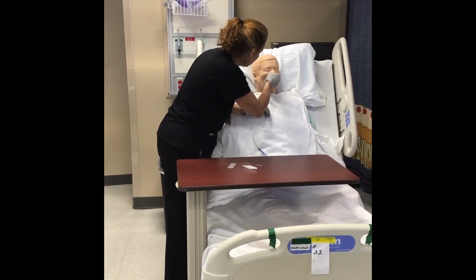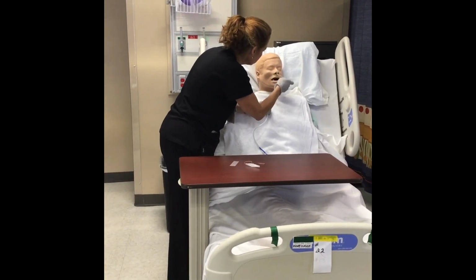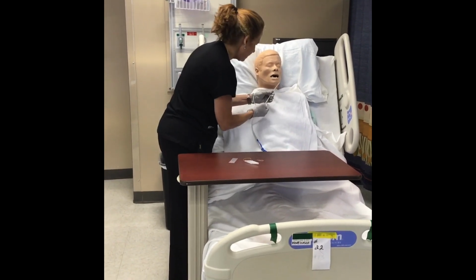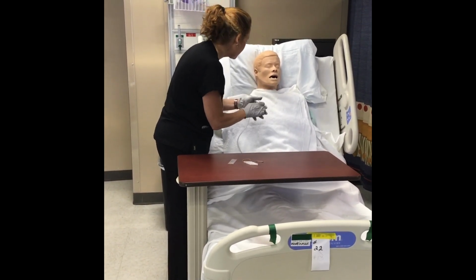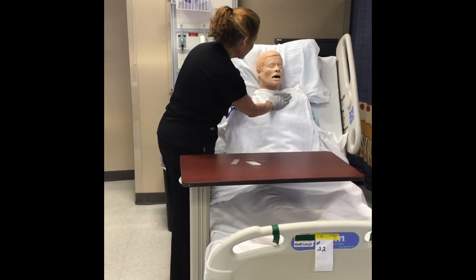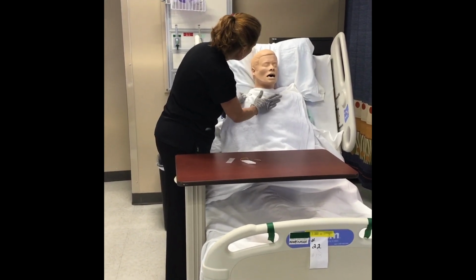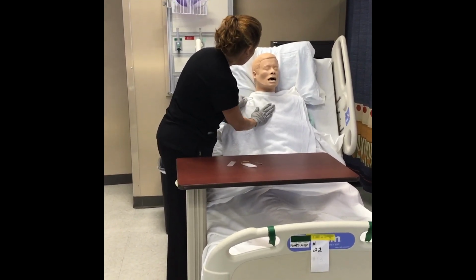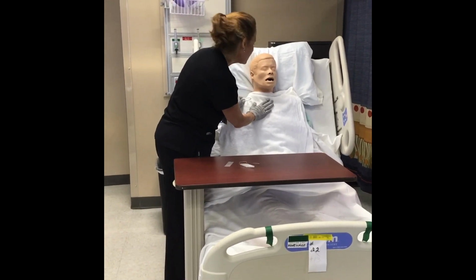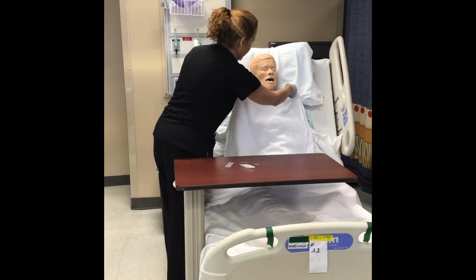1, 2, 3. Okay, it looks like the tube is intact. How did that feel? I'm glad it's out. Good, I'm glad it's out too. So I'm gonna come back and check on you in a minute. In the meantime, I'm gonna lower your bed and just probably stay at the 30-degree angle for right now, but you shouldn't have any complications. Any questions? No, thank you so much. Thank you.